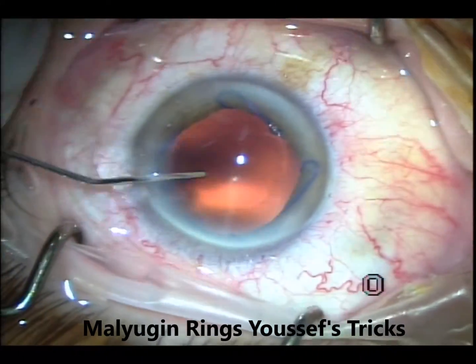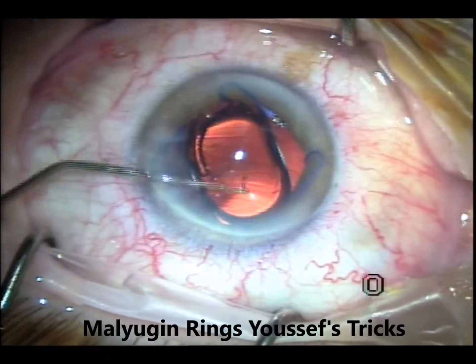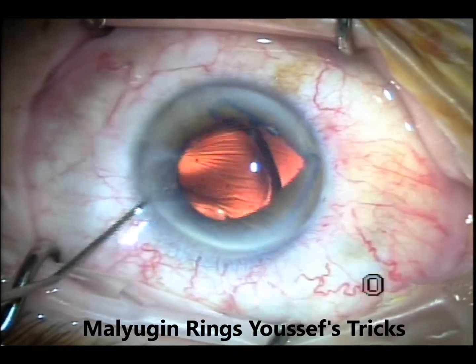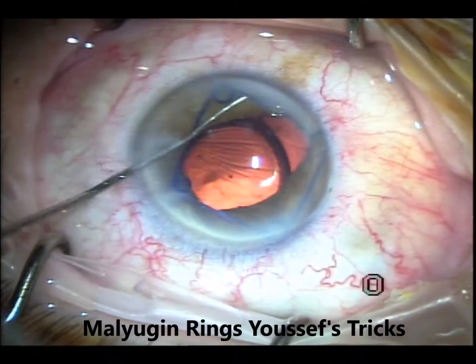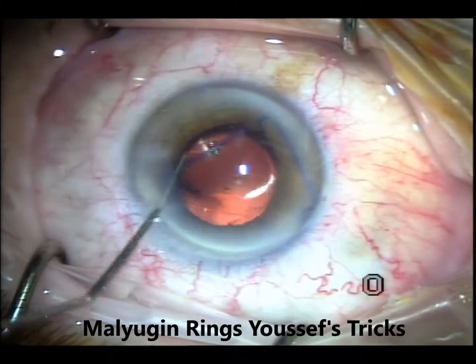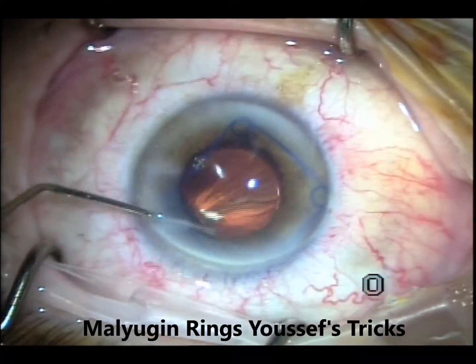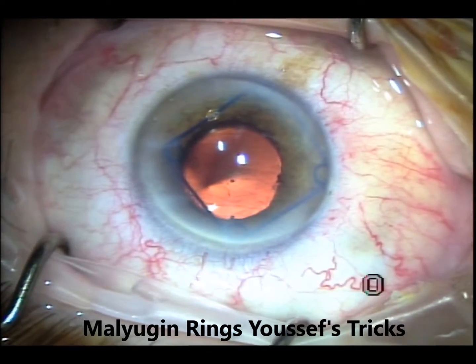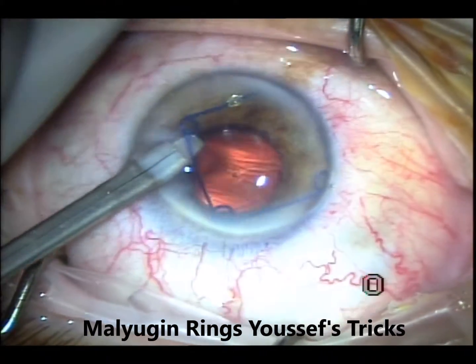The routine cataract here — just speeding through it. Implanting the lens and for this I use the Lester hook again. I will disengage the one on the right and go to the bar between the sub-incisional and the one on the left, push it away, and get the left one after that. I'm trying to put the temporal scroll close to the wound so I can engage it with the injector, but whenever I try to do that, it ends up in the sub-incisional area — not far enough from the incision, so I cannot engage it that way. I try to put it to one side but it's not engaging.